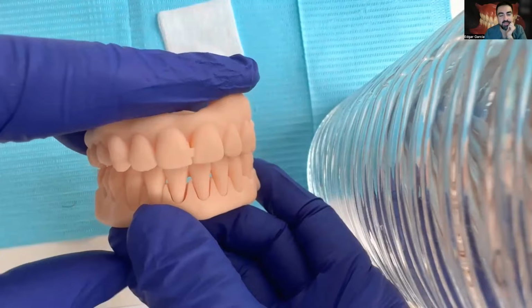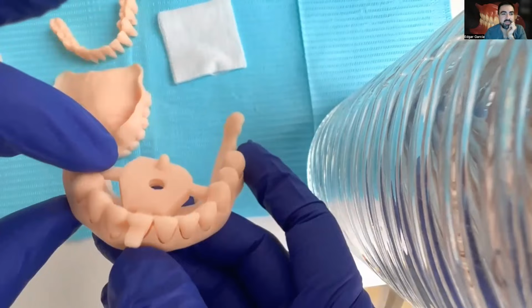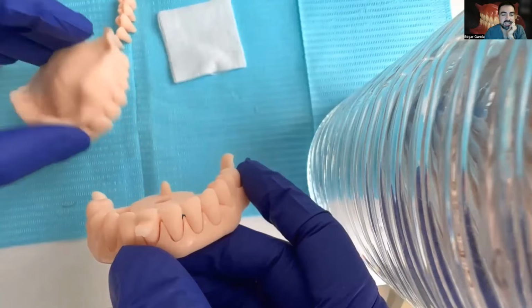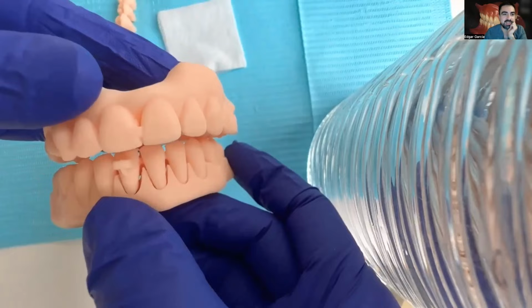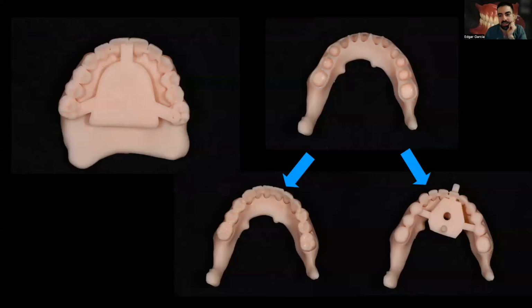This is replacing the base plate and the bite ring. So the lower one has two types of teeth. The ones that I'm going to use to take the impression, and after I take the impression, I'm going to change this type of teeth to the teeth that have the part of the tracing. So the first part of my appointment, you see the design. You see here the upper prototype and the lower prototype. You have the base lower prototype with two types of teeth. One that has anatomy, and the other one that has the pin that's going to do the tracing.